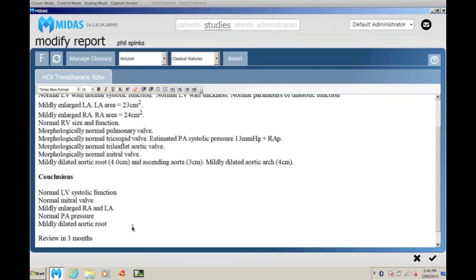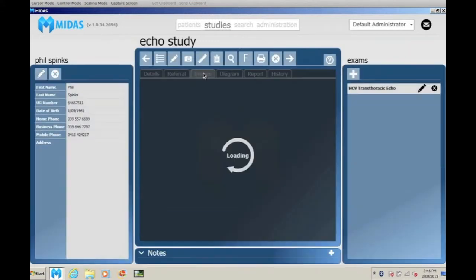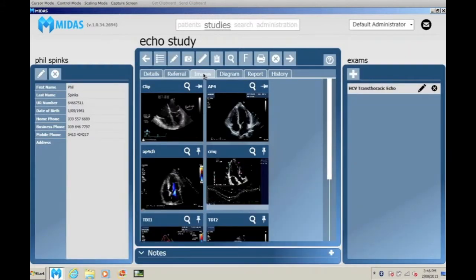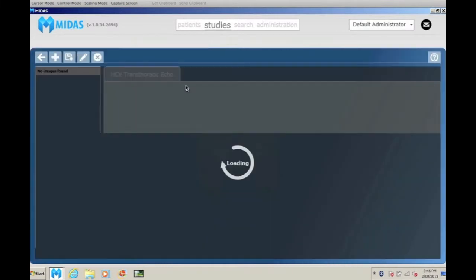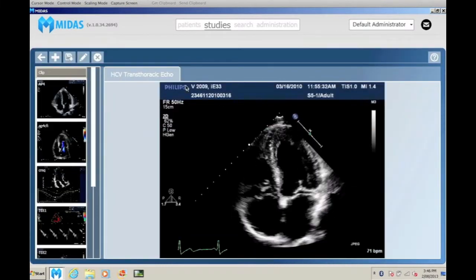Ultrasound images, video clips and other photos can be sent to MIDAS and selected pictures pinned to the final report.